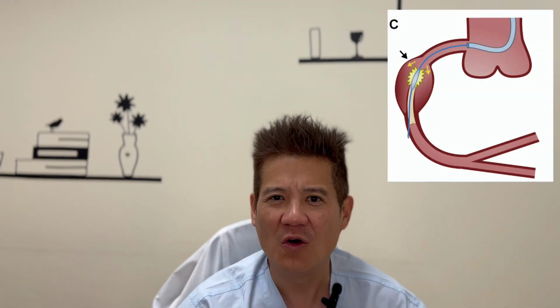For the CTO body hematoma, STRAW is very useful. Again, this is not in the paper, but you can see in the channel there's a live-in-the-box case where I did STRAW stenting. A similar technique can be used. Especially if you already have a wire in the subintimal space, just put a microcatheter down and suck on it with an indeflator while you stent and cover the entrance site. And keep sucking a couple of minutes afterwards, and you'll find you can get rid of the hematoma.